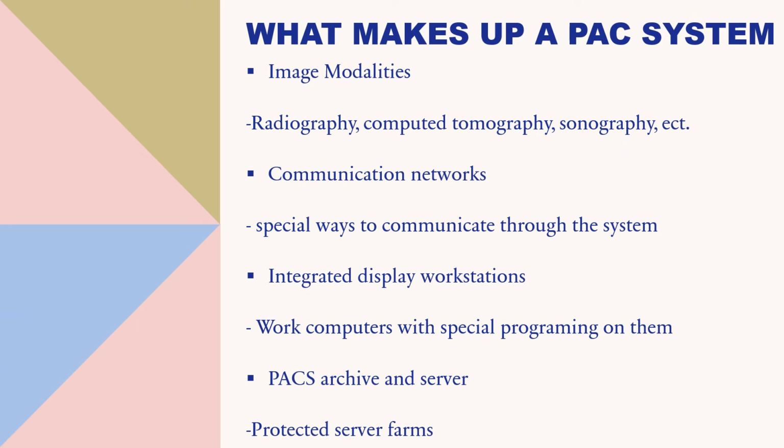So what makes up a PAC system? Image modalities such as radiography, computed tomography, sonography, and many more. It is made up of also communication networks. There are special ways to communicate through the system, and a lot of times you require a password to use the system itself. There are also special integrated display workstations that are special computers that have very specific software on them. So that combination of software and hardware makes it possible for everybody to communicate clearly and protect that patient's information.